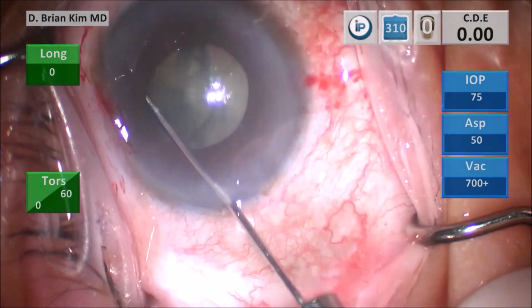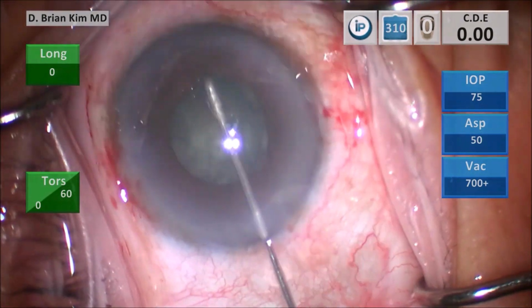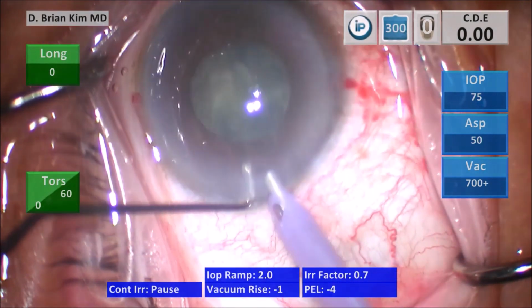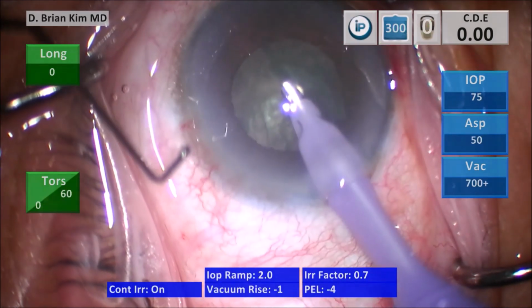I decompress on the left, and then I start to spin the lens on the right, and this happens very smoothly. I lift my incision with my chopper and then go into the eye with irrigation off to minimize Descemet's trauma. I remove the surface epinuclear material and then begin the double chop technique.